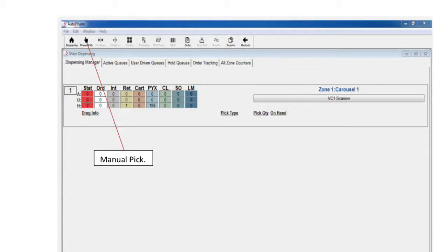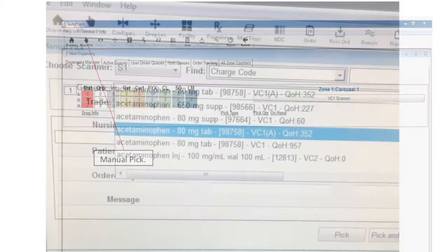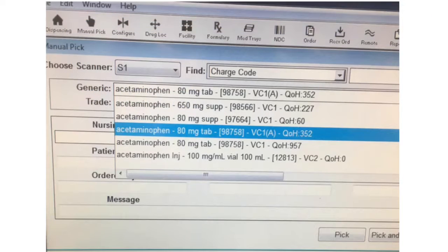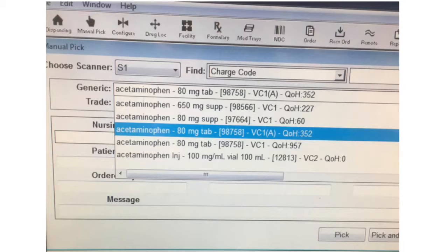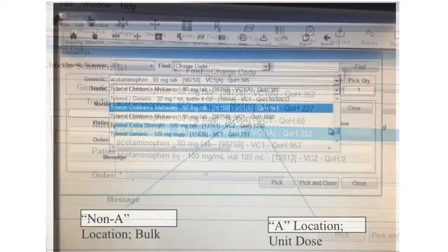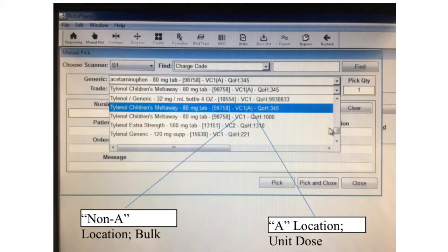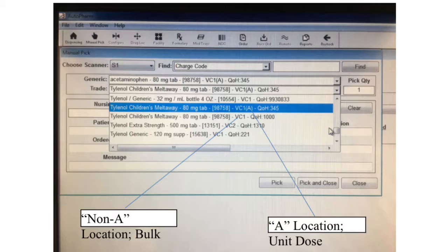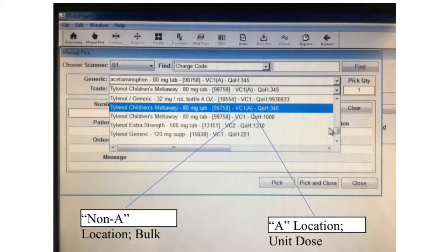To pick a single medication or listed medications, click the manual pick icon. It looks like a little hand pointing up as if to say pick me. You can search for a medication in the auto farm system by trade or generic name. It is important to pay attention to A locations and non-A locations. A locations are unit dose tablets. They share a bin with a bulk bottle of the same medication. Bulk bottle tablets are non-A locations.